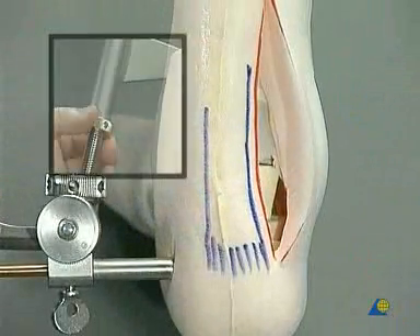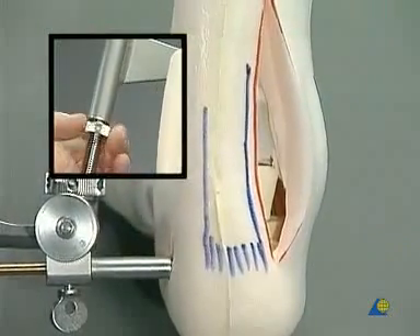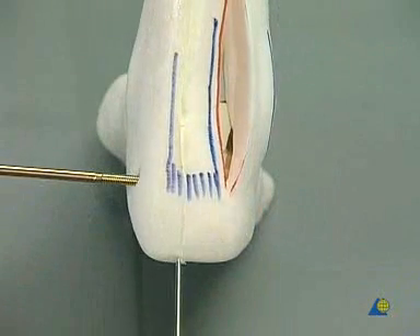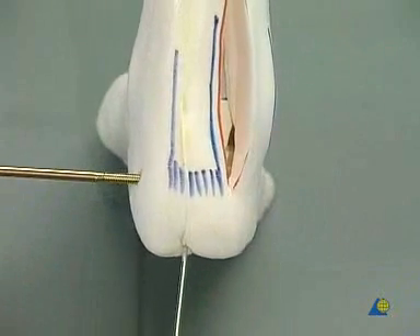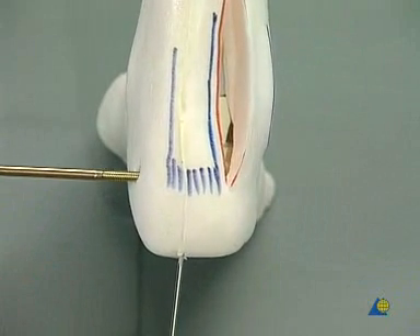The axis of the hindfoot must be under constant control as distraction is released. A 1.6 mm K-wire is placed percutaneously from the calcaneus to the talus to keep the bone block in place.